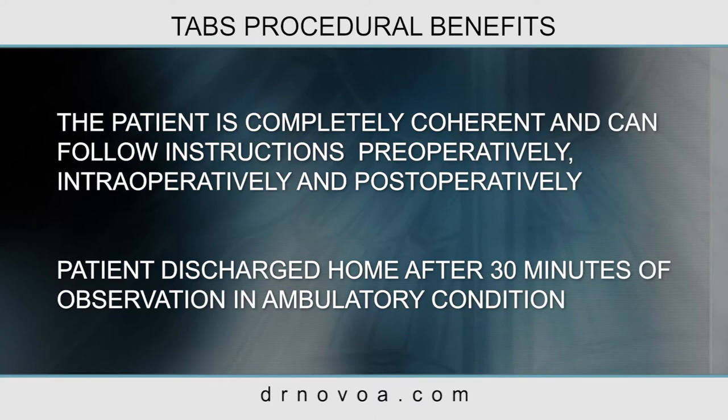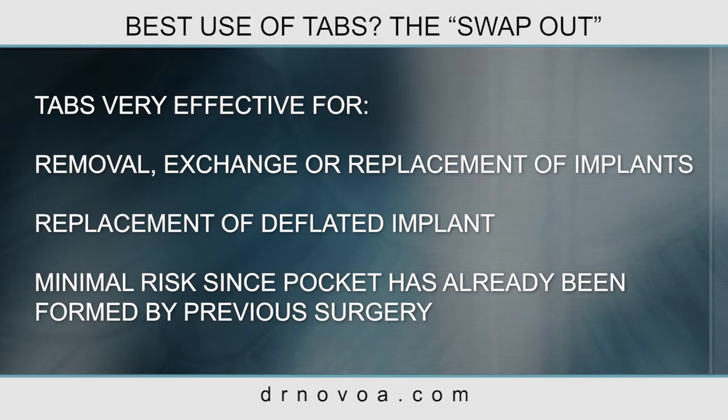One of the best uses of TABS is the swap-out, which is very effective for the removal, exchange, and replacement of implants.